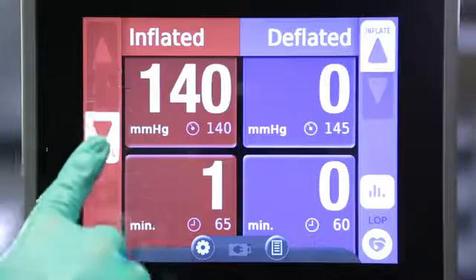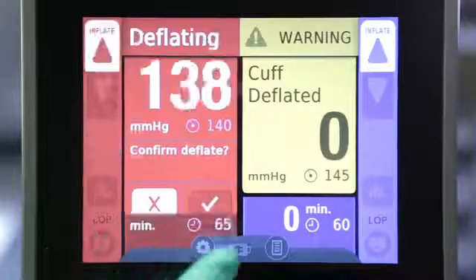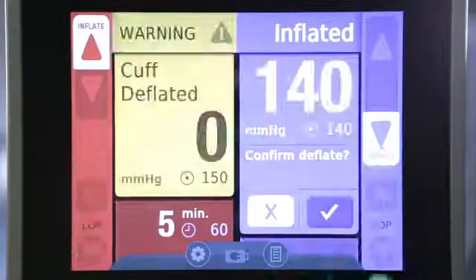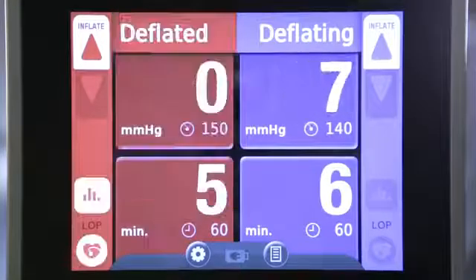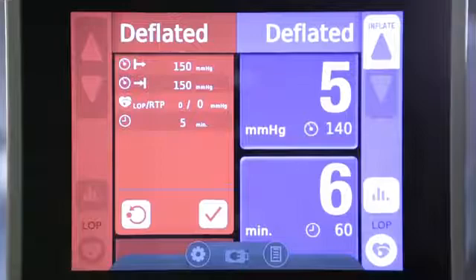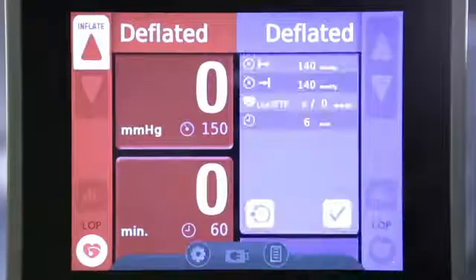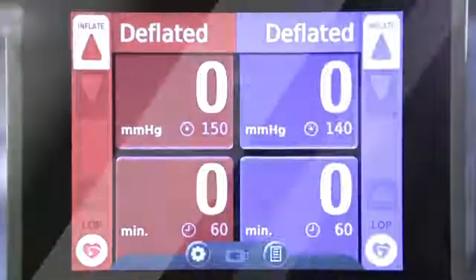To deflate the cuff at the end of a procedure, drag and hold the deflate button for 3 seconds. If the second cuff was inflated, you must always confirm deflation. Once the cuff has been deflated, a statistics icon will illuminate. Tap this icon to see starting pressure, ending pressure, LOP, and time the tourniquet was inflated. Tap the reset button to zero out the statistics. The statistics must either be reset through this process or by restarting the machine before the next procedure.